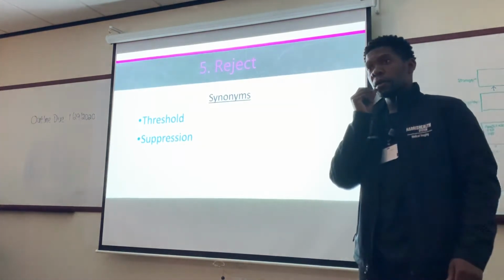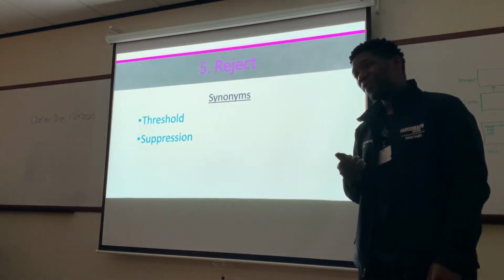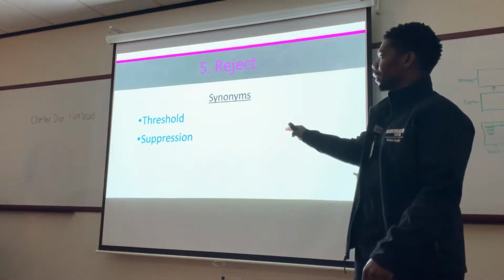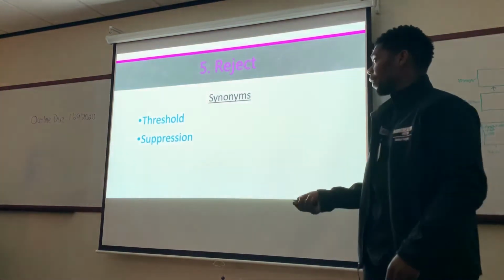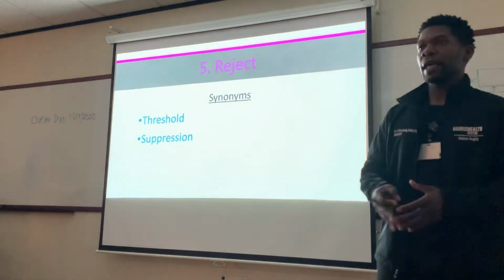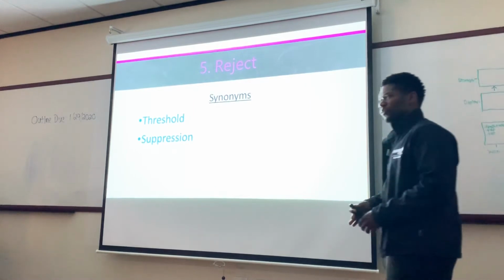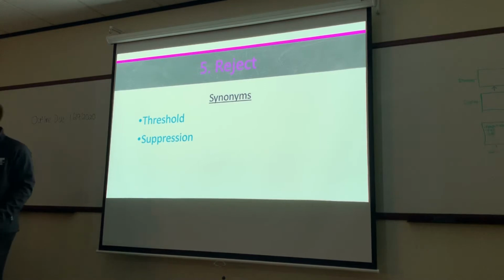Isn't compression suppression too? Because the meaning of compression is suppression too, right? Somewhat. I can see what you're saying there, but don't get that confused with reject. When they talk about synonyms, they're talking about more of a labeling thing, how the machine is going to be labeled. And yes, I have seen suppression on the machines, but that's also reject. Compression is basically, I have this much, now I'm making this much. I have to look up the exact definition of what suppression actually is. I think they're similar, but they're two different words, so there has to be a difference, right?